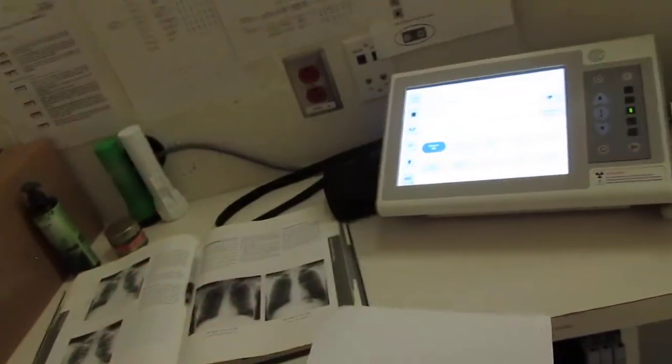Okay, this is my chest x-ray. My first step is to check the order. So I'm going to go over and get the order, and I'm going to find the patient's name and what kind of x-ray it is. It says it's a chest-2 view, PA and lateral, and I see the birth date and the patient's name is Jane Smith. So I'm going to set up my x-ray room.